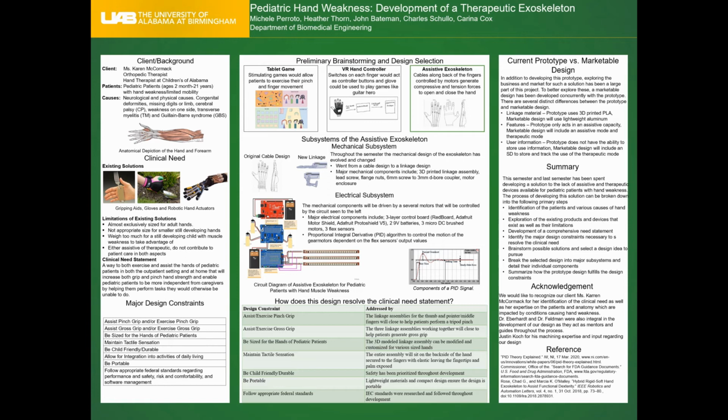Additionally, user information is a key difference. The prototype does not have an ability to store user information, but the marketable design will include an SD card to store and track the use of the therapeutic mode by patients. To summarize our product, this semester and last semester has been spent developing a solution to the lack of assistive and therapeutic devices available for pediatric patients with hand weakness.